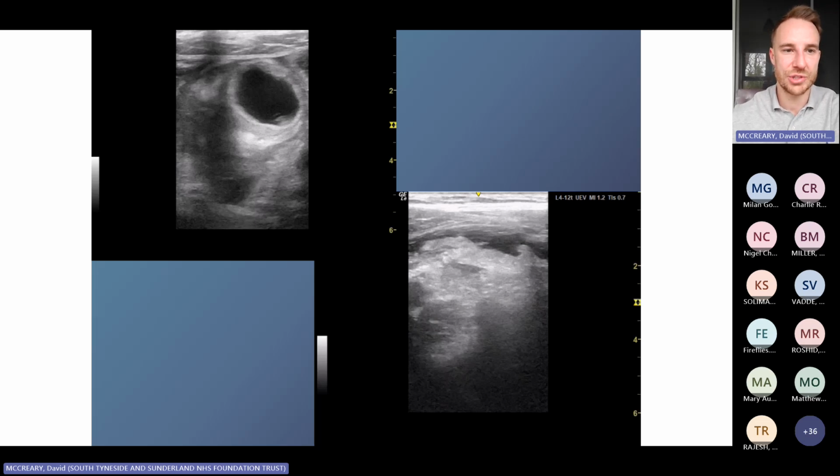Again, we've got pretty much a full house of different things here. We can't really see an appendix. I think that's 2 centimeters, so that's not your appendix, but we've probably got a loop of bowel. We've got lots of brightness. We've got lots of other signs we're going to talk about later, which is almost a static ileal loop here that's not really doing too much, and little pockets of free fluid in between. And then we've talked about this one before, with this just all being much, much brighter than expected.